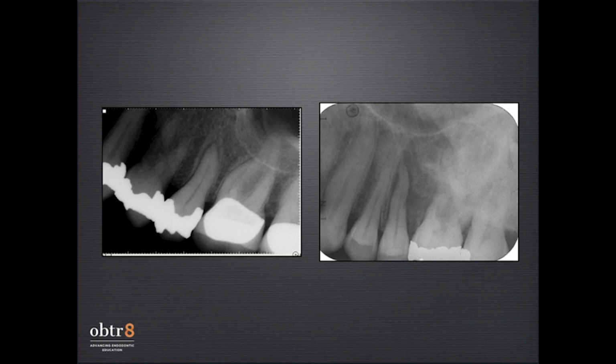I can't tell you how that tooth would test. We could see a variety of different possibilities depending on the malignant infiltrate that's there. That tooth may not respond to a thermal stimulus, it may. I don't know the answer because that's a case from the pathology days rather than my endodontic practice.